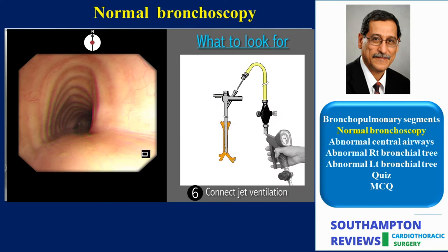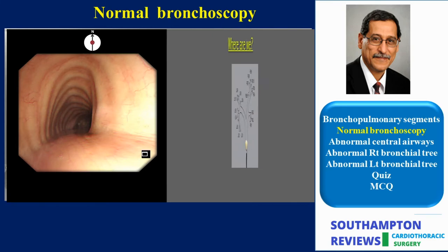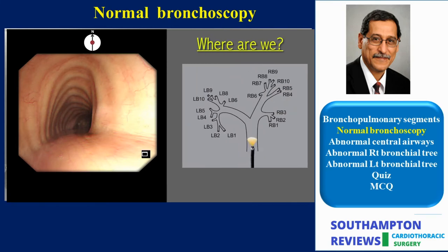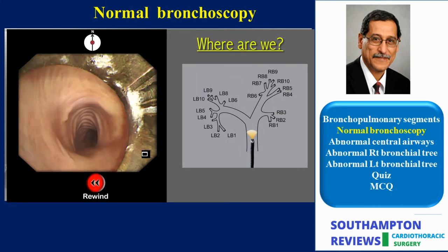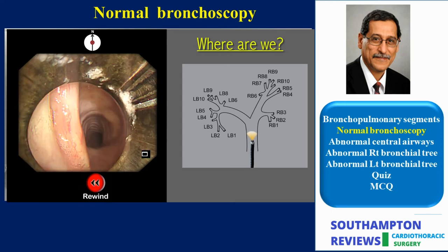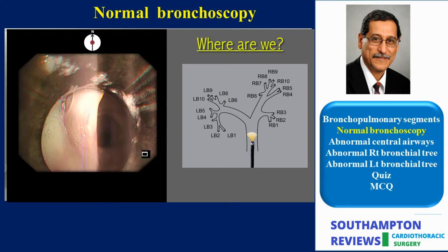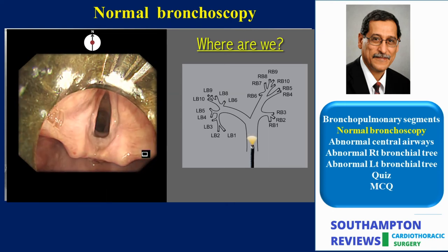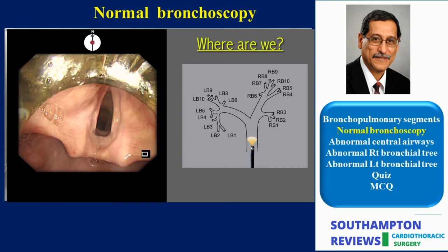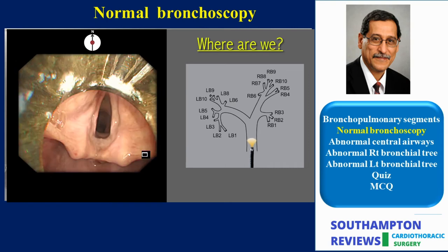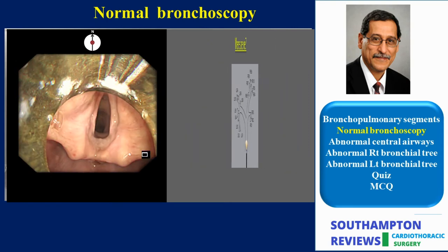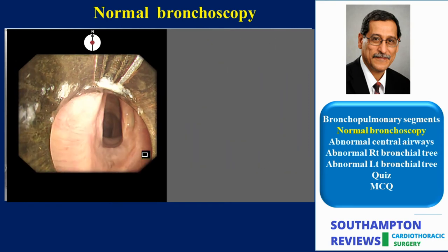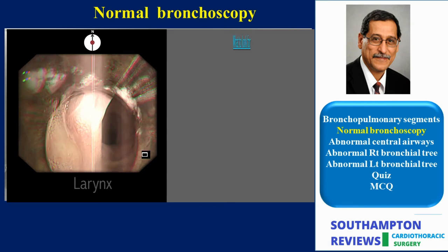Once in the trachea, the Venturi device is connected to the rigid scope to establish ventilation. The operator can now relax and pay attention to introducing the flexible scope through the rigid one to examine the central airways. Once the vocal cords are passed, we enter into the larynx.